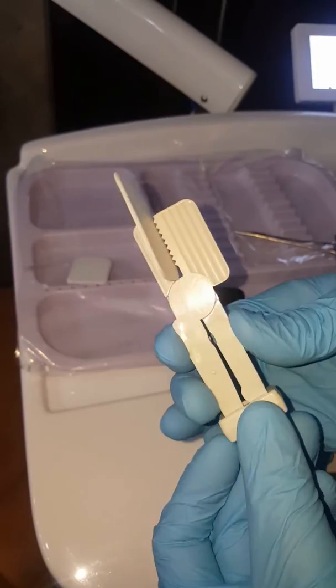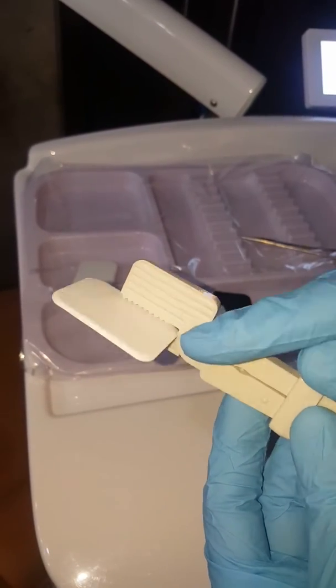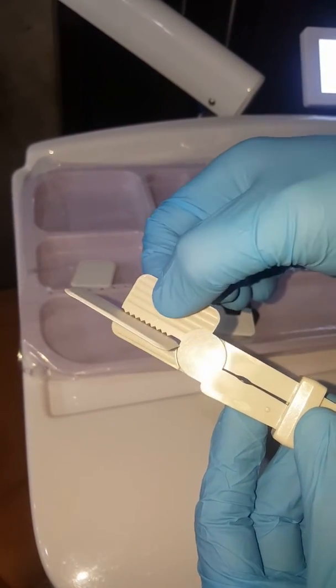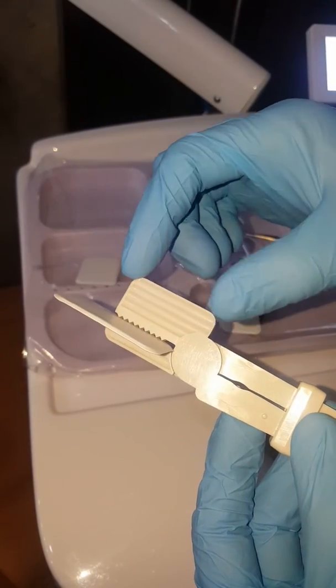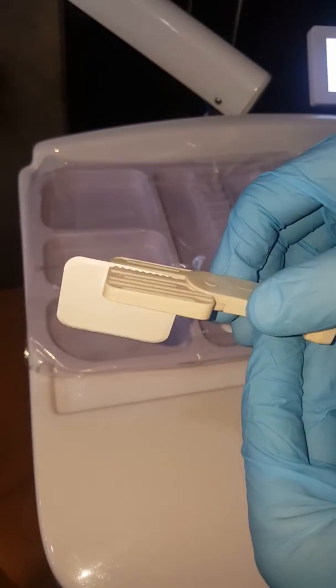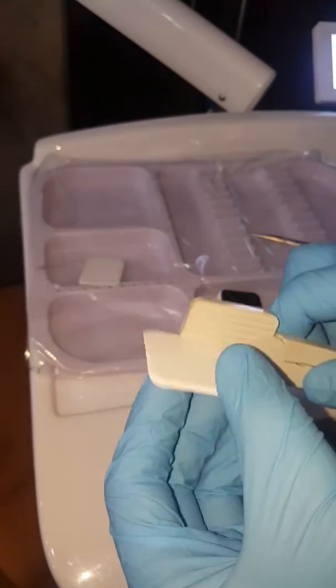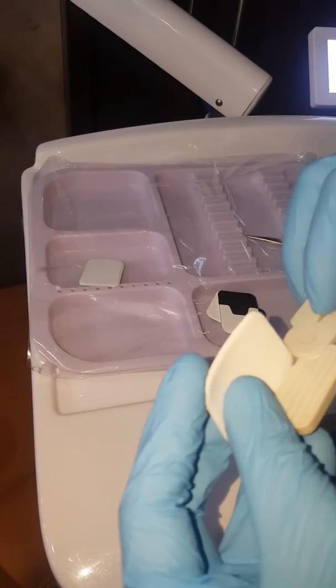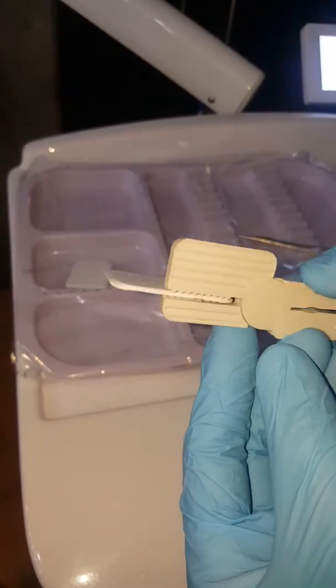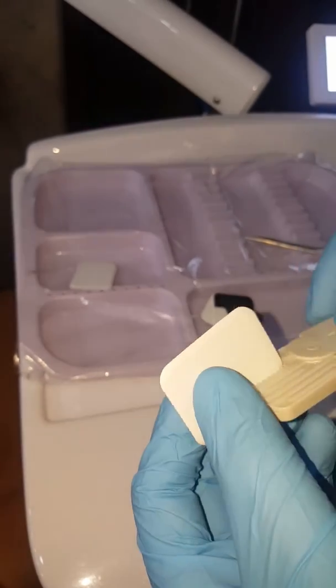In the film holder you hold the film as such. This film can be used for the upper left side, and the patient bites down. It also positions the film right in the back. This one can be used now for the upper right side or lower left side. So that's how it goes.